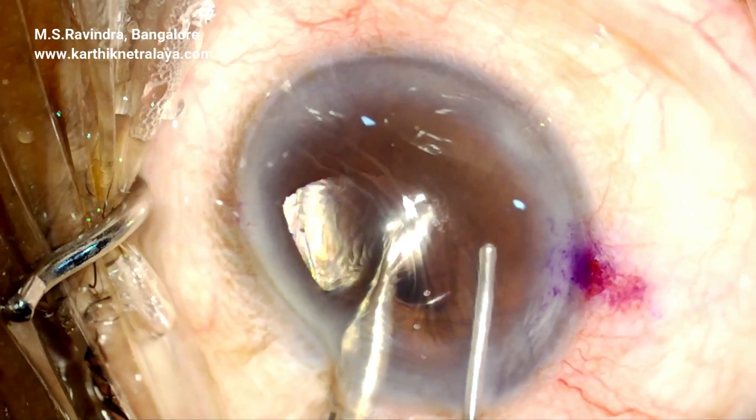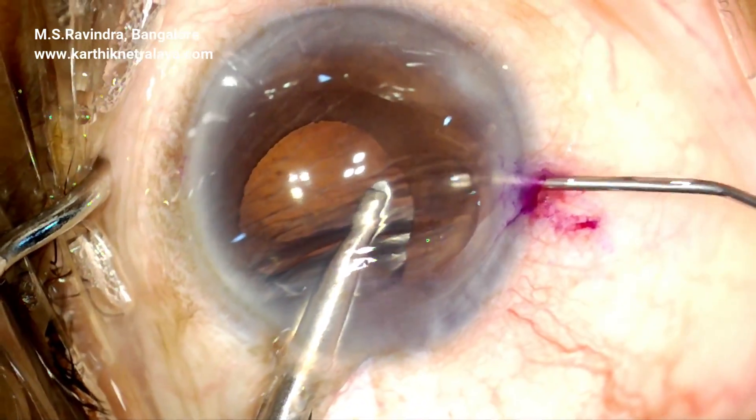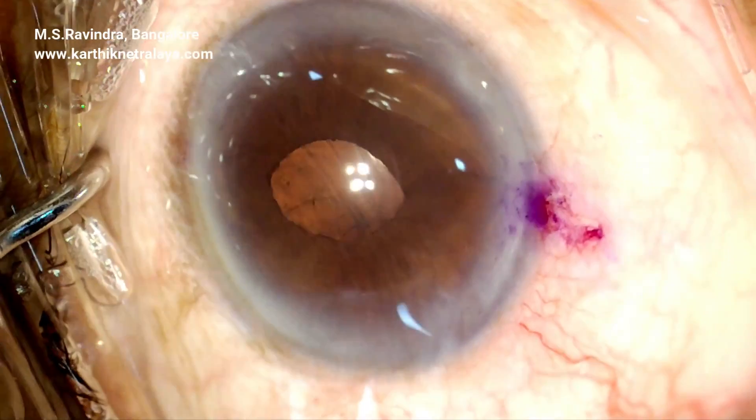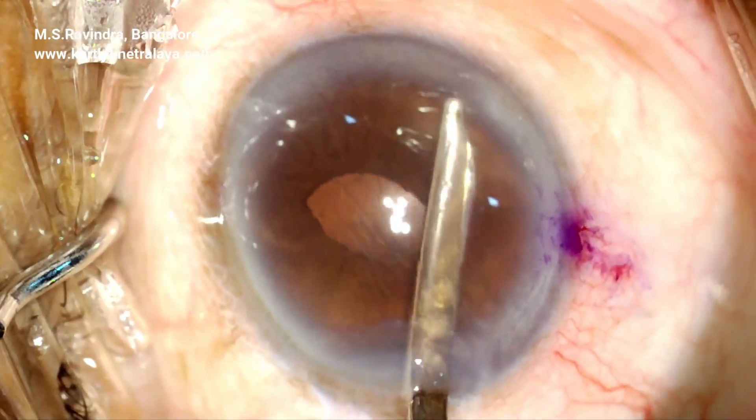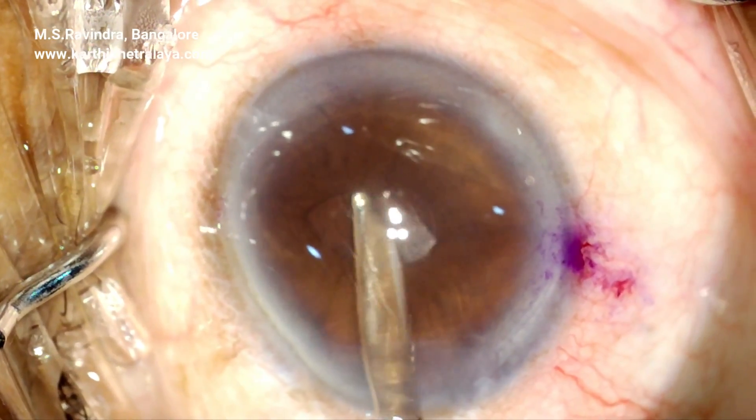Visco fills the eye after you hold the optic. The optic is held at the periphery close to the haptic, and the other end is also enclaved. Visco is completely aspirated.